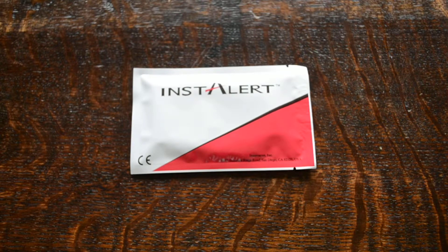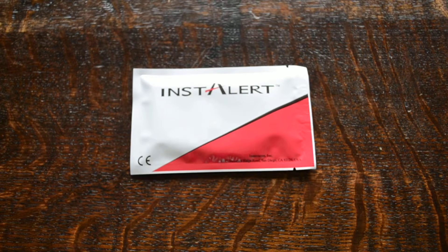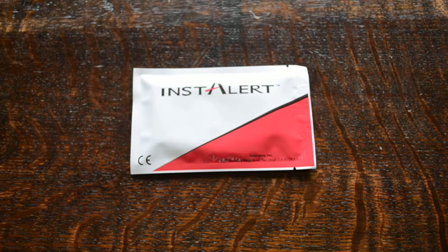In this video presentation we're going to show you the Instalert seven panel drug screening test. Instalert is an international brand of drug of abuse screening tests made by Innovacon Inc.